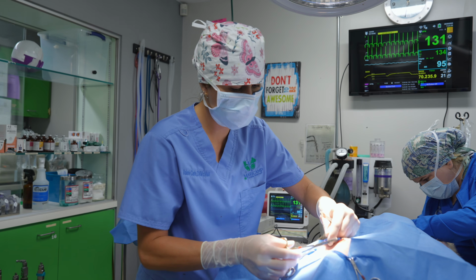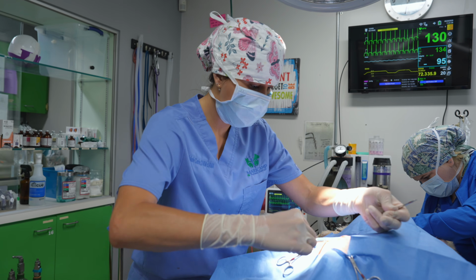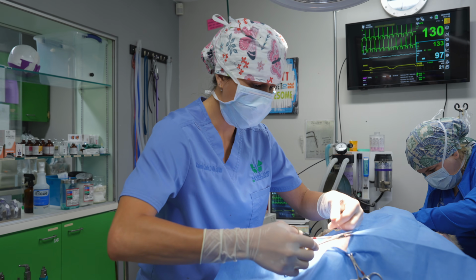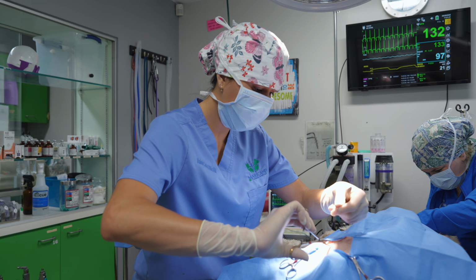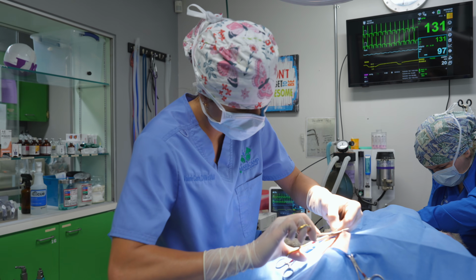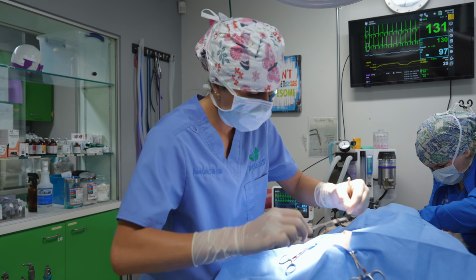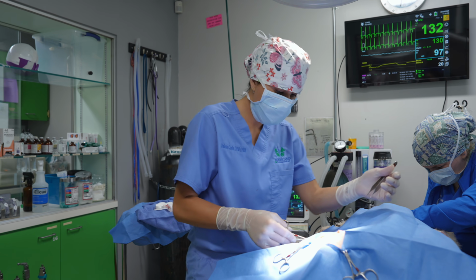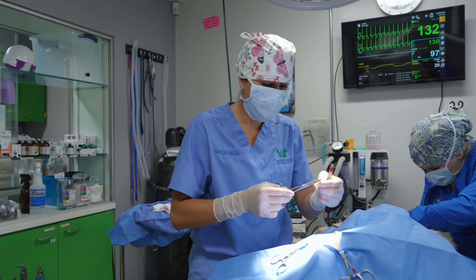This one was a really simple one. It was just on the skin. I still like to oppose my edges with internal, just the way I like to do it. Not necessary, but just more secure. And also it's on the hip, so this area has a lot of mobility, therefore it's better to secure it.